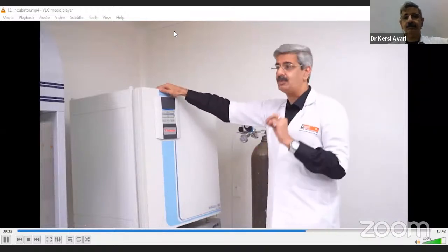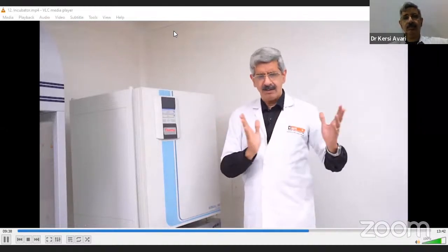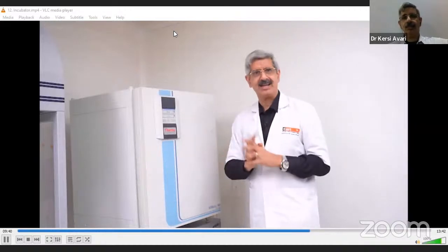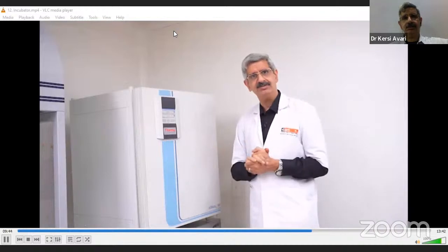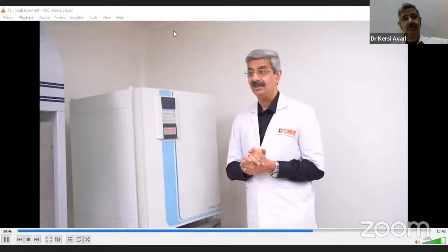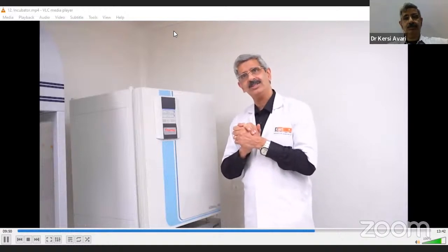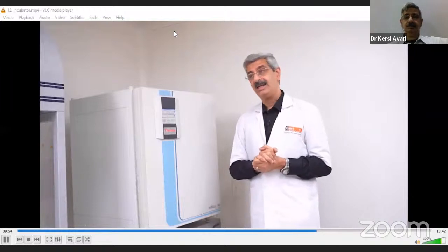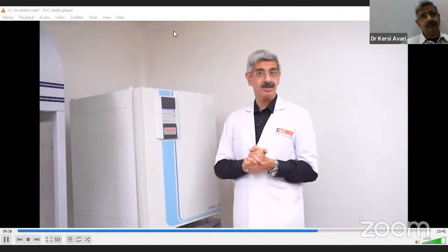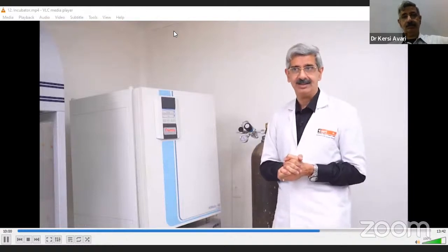And another question which people always ask: I am holding my batches 5 times a year or 6 times a year. In the mid time, shall I shut my incubator off? Well, a little bit of yes, a little bit of no. Because if you were to run your incubator continuously, you'll have to keep the air conditioning on. And in places where there are power failures and power surges, it's very difficult to maintain the AC 24/7, 365 days.